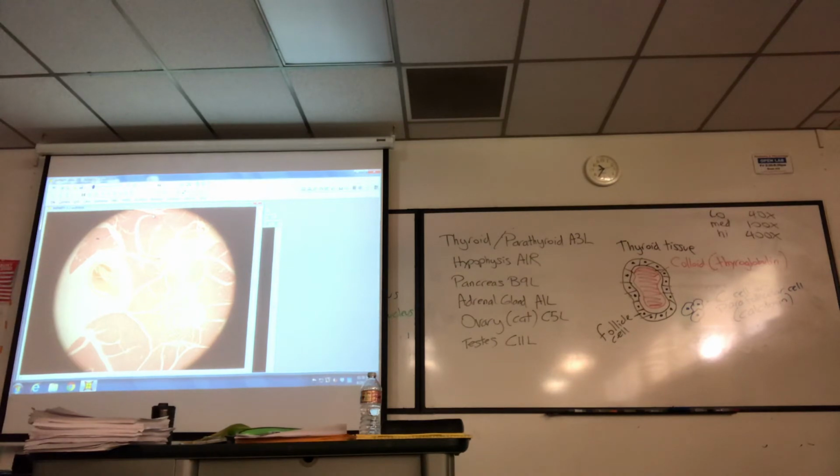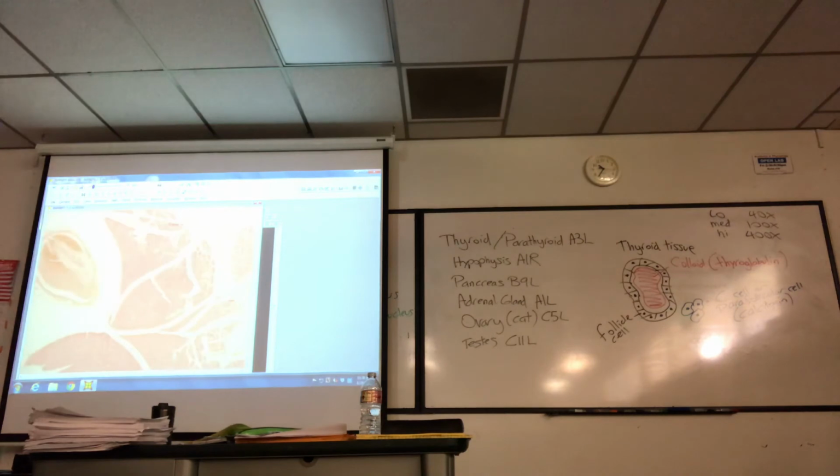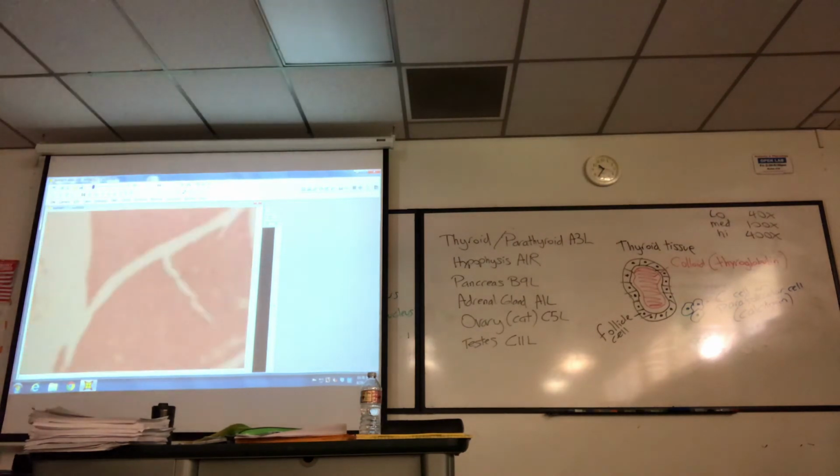This is 20x. I'm going to go higher now. I want to take a picture of this. 40x. Here's 100x.